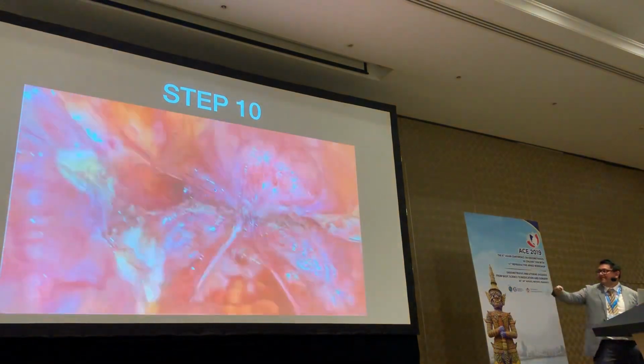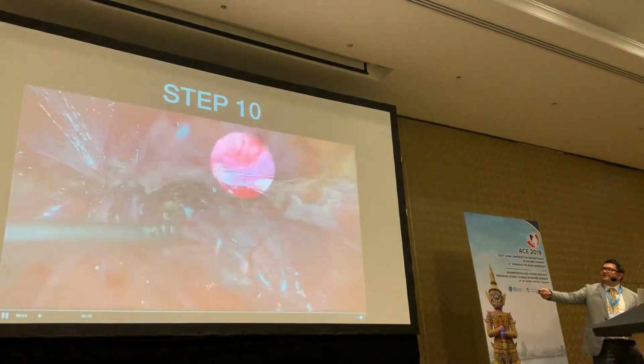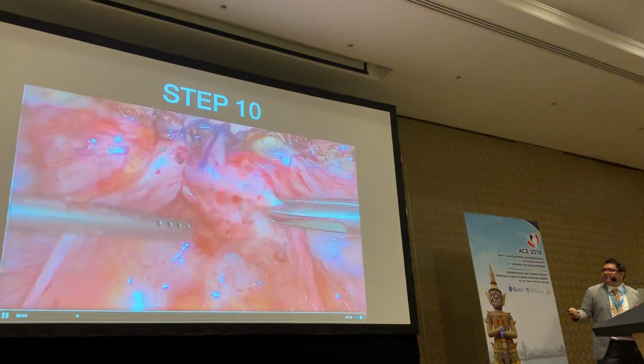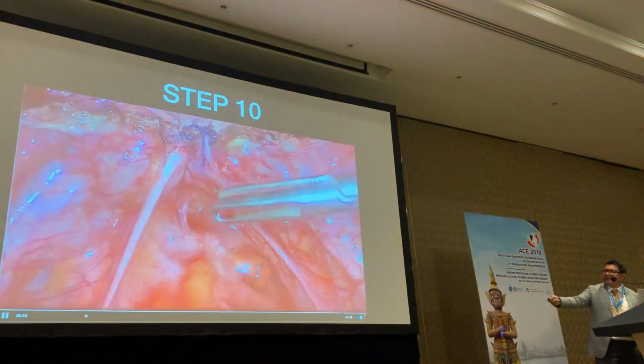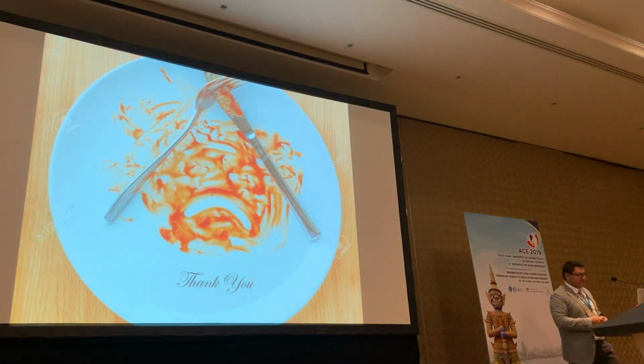So the last step is hemostasis. See, I said I do close my peritoneal cuff. I've done a salpingectomy and removed it through the ports. There's a little bit of endo at the end, which I excise, but that is not for here. And just a final take-home message is learn to use both your hands, and this is how you should train your juniors and your fellows. Hemostasis should be meticulous to enable you to be fast and efficient, and use minimal instrumentation that will save you time. Thank you very much.